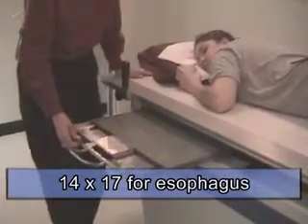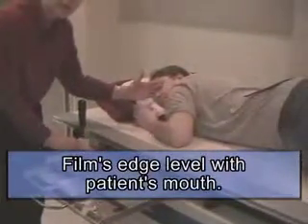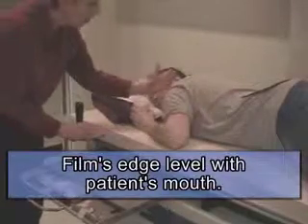At the table, the patient Kristen is set up for an RAO of the esophagus. For an esophagus, we generally use a 14 by 17 film with the ID at the top. The film's edge will be level with the patient's mouth. The esophagus runs anterior to the spine, so the crosshair is placed approximately two inches anterior to the spinous process, which can be confirmed by centering down the patient's neck.